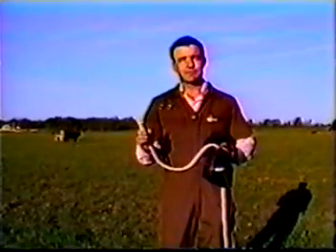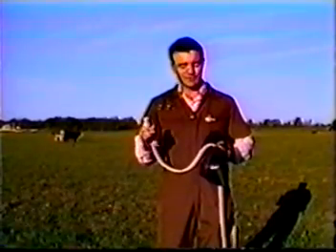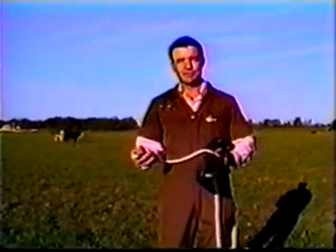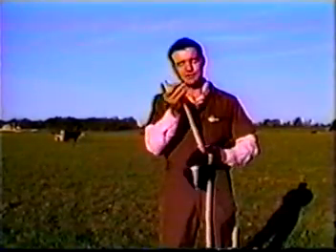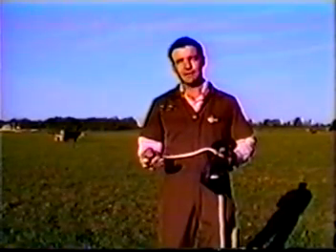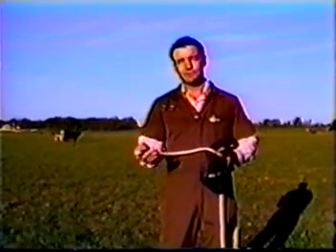Now some tips on holding the transducer when doing a fetal sexing procedure. I've found that getting the fetus in position is the most critical portion in doing fetal sexing, obviously, other than knowing how to read the monitor and know what you're looking for. But getting that image requires a tremendous amount of practice and quite a lot of knowledge on how to approach your subject.